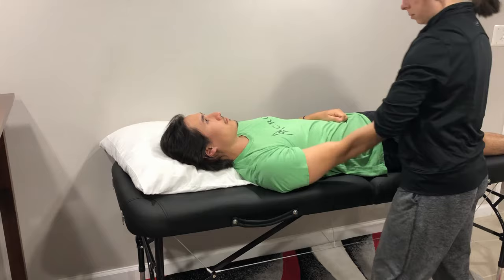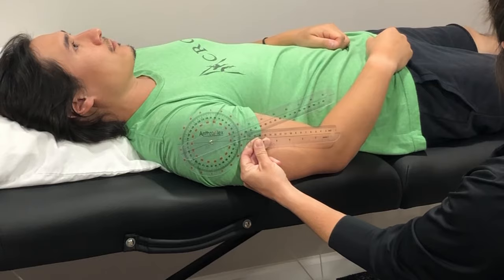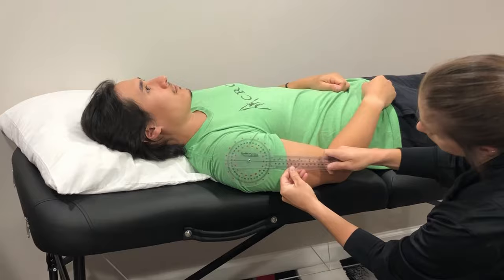To check active range of motion, I'll line the fulcrum up with the lateral aspect of the greater tubercle of the humerus. The stationary arm will line up parallel to the mid-axillary line of the thorax, and the moving arm will line up with the mid-line of the humerus.